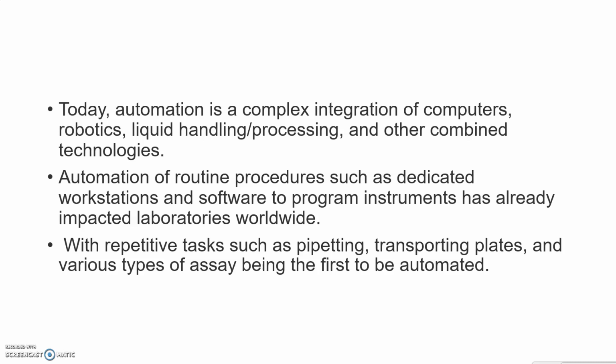Automation of routine procedures such as dedicated workstations and software to program instruments has already impacted laboratories worldwide, with repetitive tasks such as pipetting, transporting plates and various types of assay being the first to be automated.